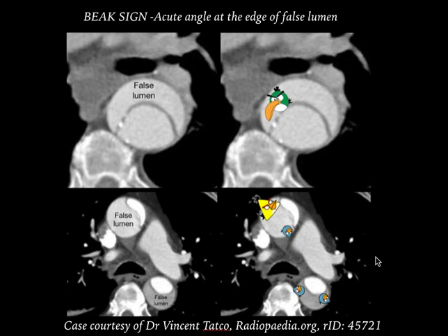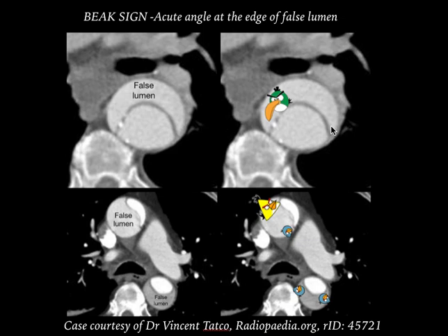Now let us see the beak sign. This is an excellent illustration from Radiopaedia by Dr. Vincent Tatco. You can see the intimal flap, intimal calcium displacement, false lumen, and true lumen. The contrast density of the false lumen is less, while the true lumen has higher density. The false lumen is larger and the true lumen is smaller. The beak sign is an acute angulation at the edge of the false lumen — you can see the acute angle here. Once you find this acute angle, that is the false lumen. It is the most important sign for differentiating true from false lumen.